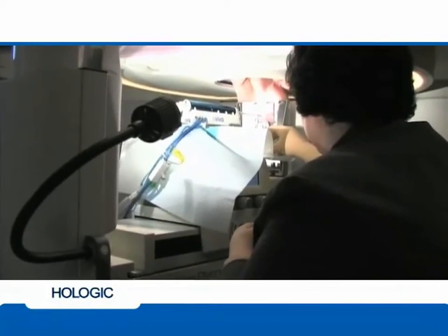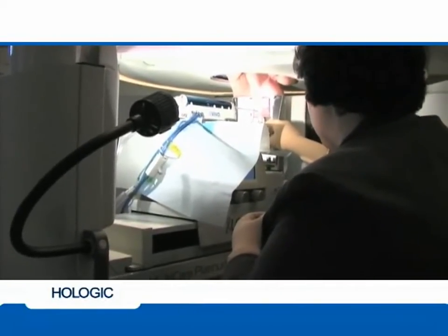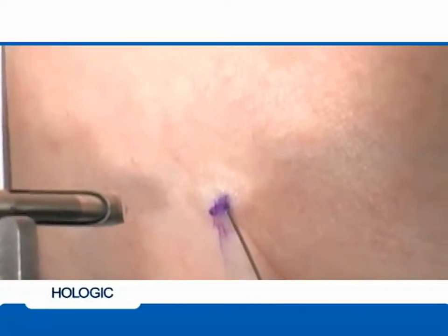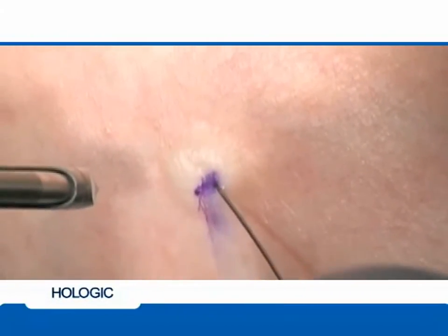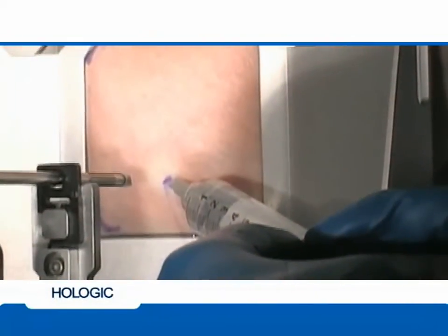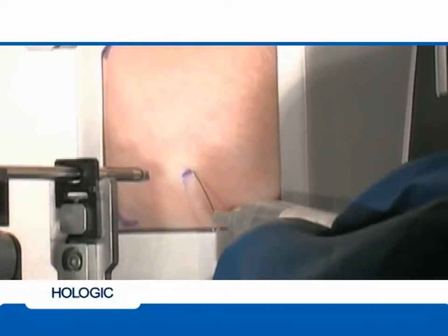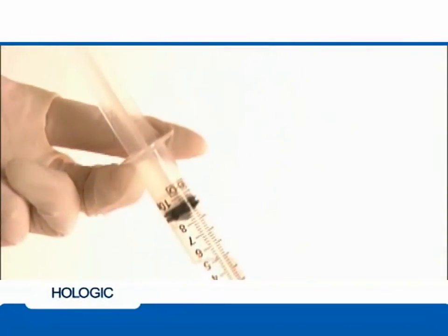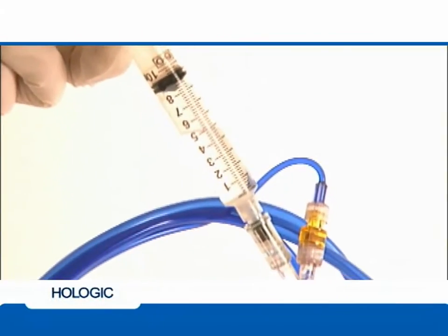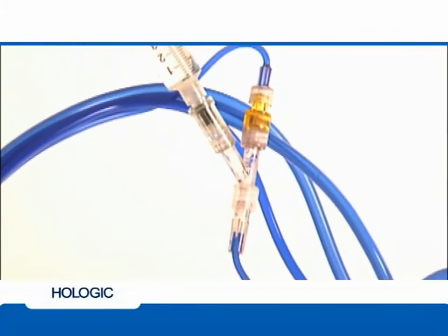To increase patient comfort during the biopsy, an anesthetic is injected to numb the skin surface at the area of interest. Deeper tissue will then be anesthetized by injecting deep to the target site. The tip of the biopsy needle will extend beyond the target site, so it is essential to administer anesthetic beyond this point. Remember, if a syringe of pain medication has been attached to the Y valve, this pain medication delivery system will assist with patient comfort as well.